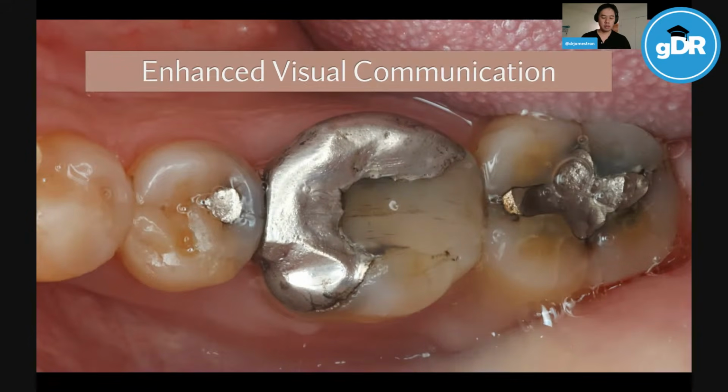I like photography because it really shows the finer details in your teeth. You can see the real fine details in the cracks here on the second molar and the first molar. You can see the wear on the amalgam. You can see the streak and the wear on the composites on the DO of that 6. You can see the crack on the premolar.